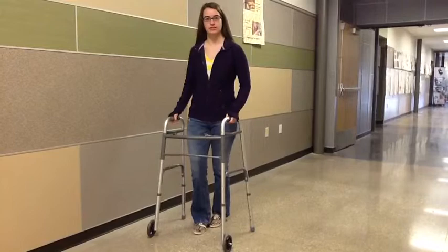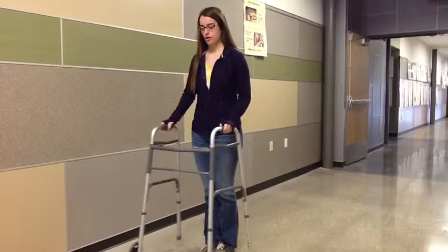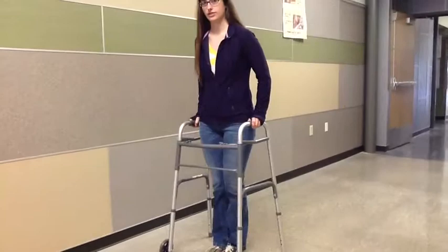When using a walker, you have to make sure it fits right. To know whether it's big enough for you, it must line up with the crease of your wrist. To walk with it, you want to bring the walker out in front of you without bending or leaning on it. Then you take a step in, and then another step in. You never want to cross this threshold.